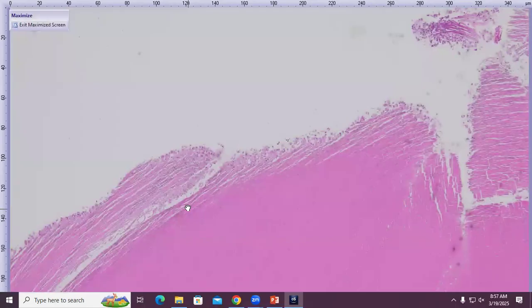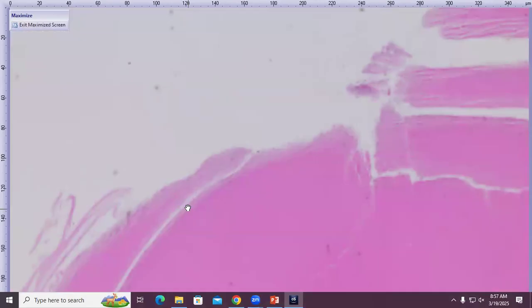But regardless, the presence of those macrophages nibbling on the lens fibers helps to confirm that this was indeed a true in vivo lens capsule rupture with extrusion of these fibers, and the macrophages are responding to them as if we needed additional proof that it's a real rupture, but it is additional proof.